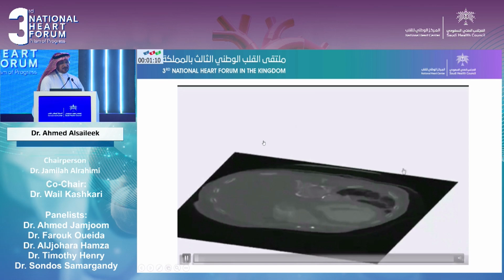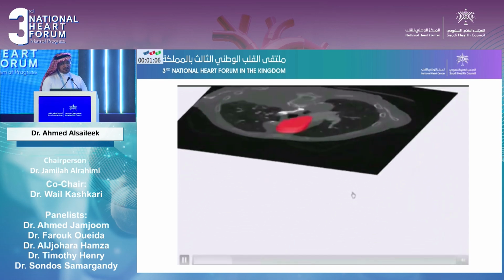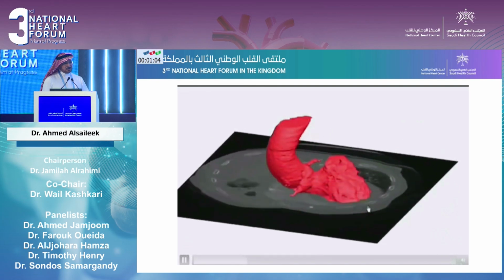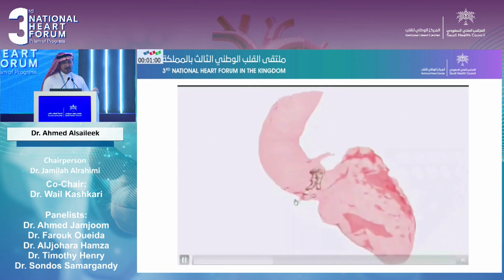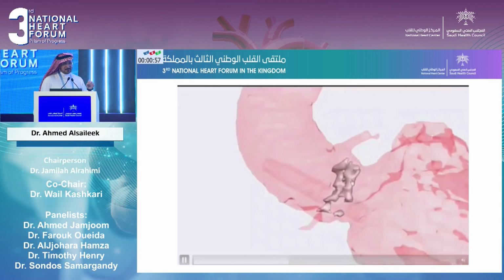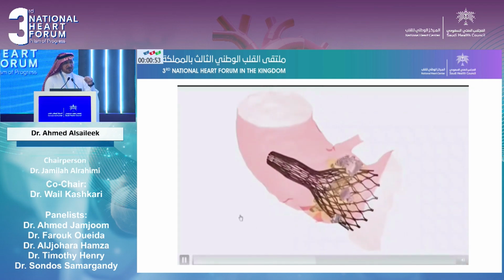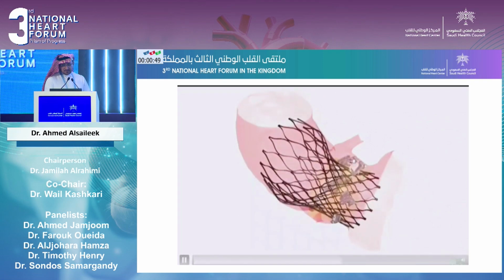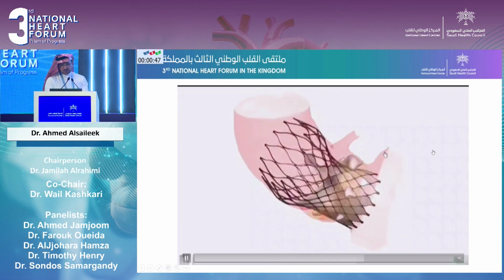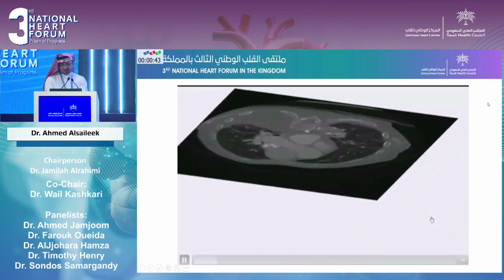Ideally, I think in the future we should have all this automated, and we feed all this information to the computer, and the computer will do modeling and will insert a valve inside that degenerated bioprosthetic valve, and will give us all the risk or simulated risk of coronary obstruction. Do we have it yet? I'm not sure that we have it yet, but I think we should in the future.